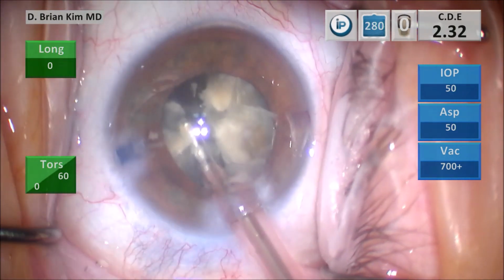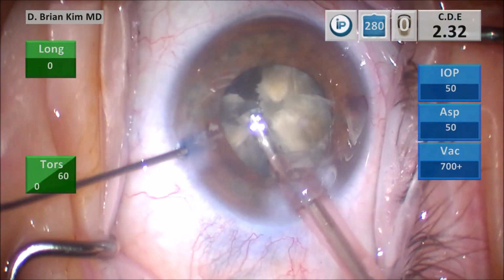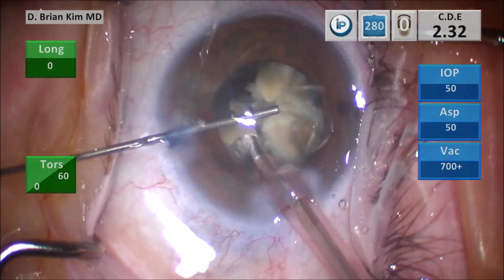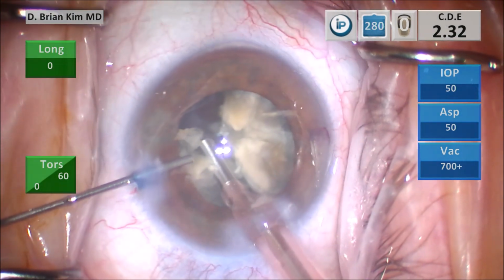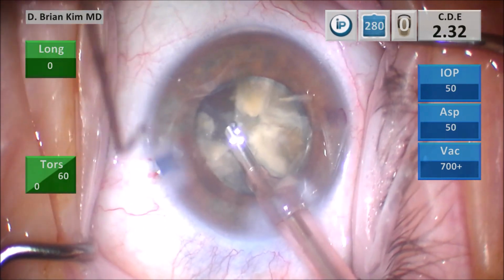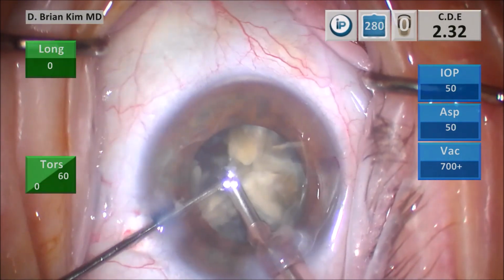I take the chopper out and I'm going to push some more viscoelastic to coat the corneal endothelium at this point. I want these patients to have clear corneas post-op day one whenever I can. So I'm really generous about viscoelastic, and I'm also very stingy with the ultrasonic energy.